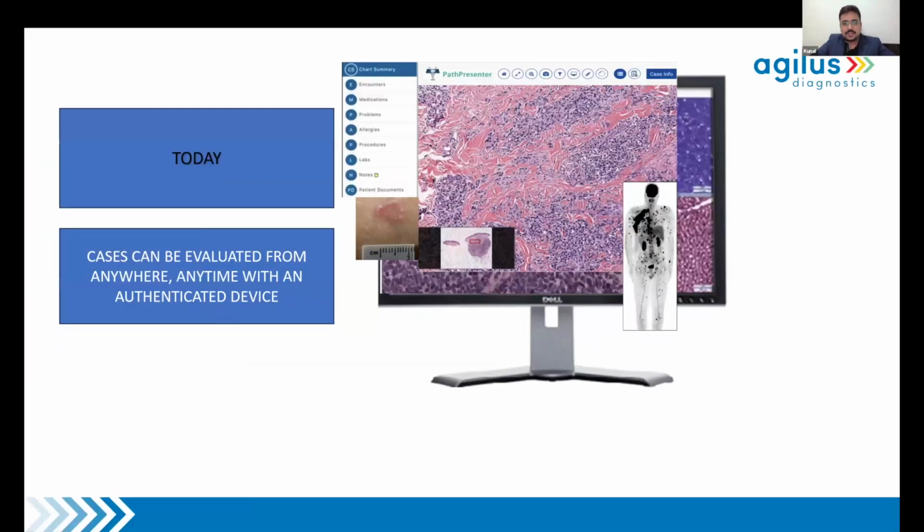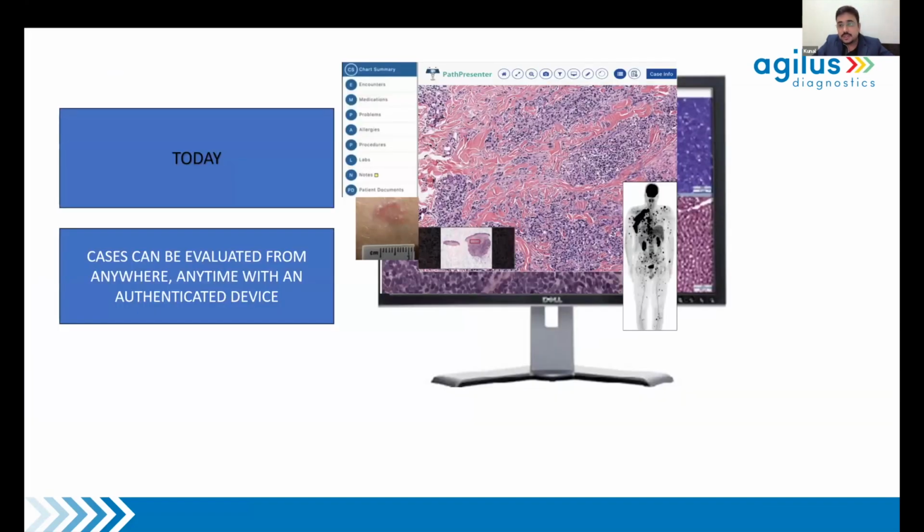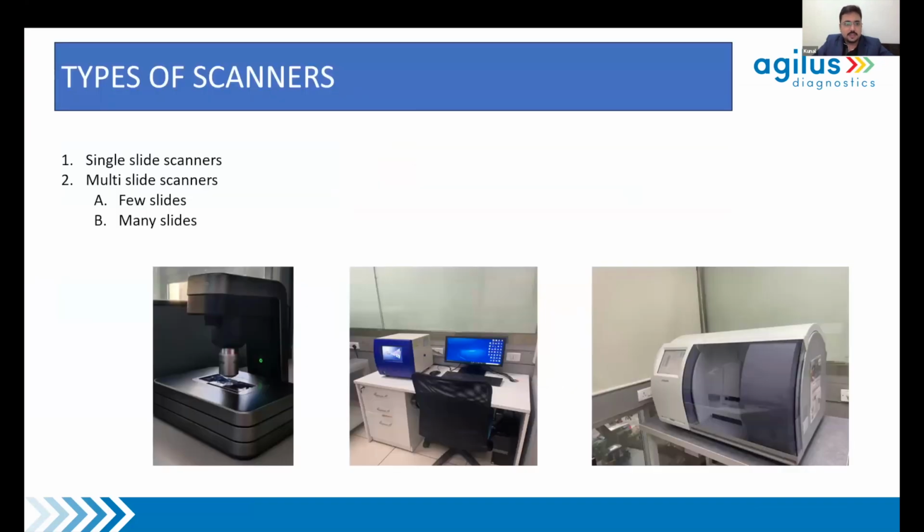Even for educational purposes, we have moved from a multi-header microscope to the screen, which enables hundreds of people to view the same slide at the same time, from anywhere, anytime in the world, from an authenticated device.